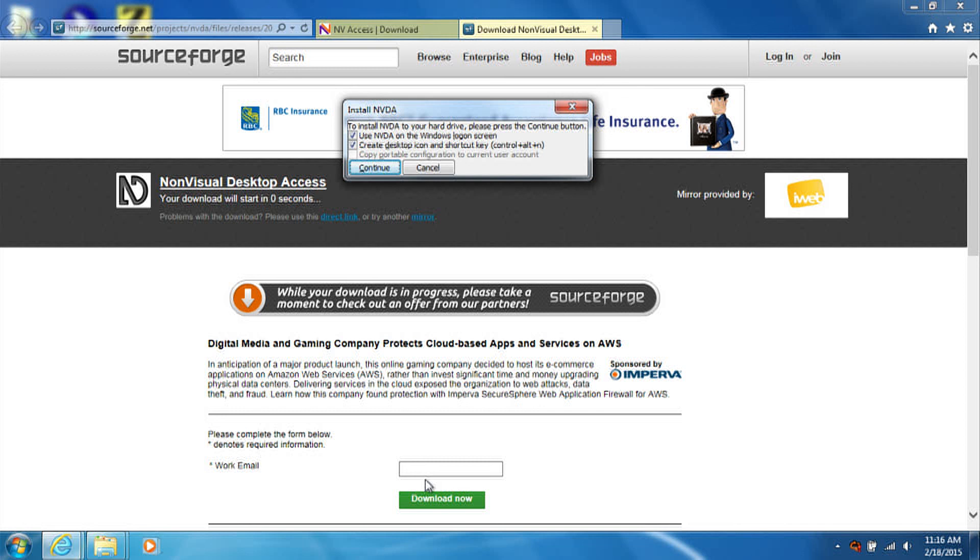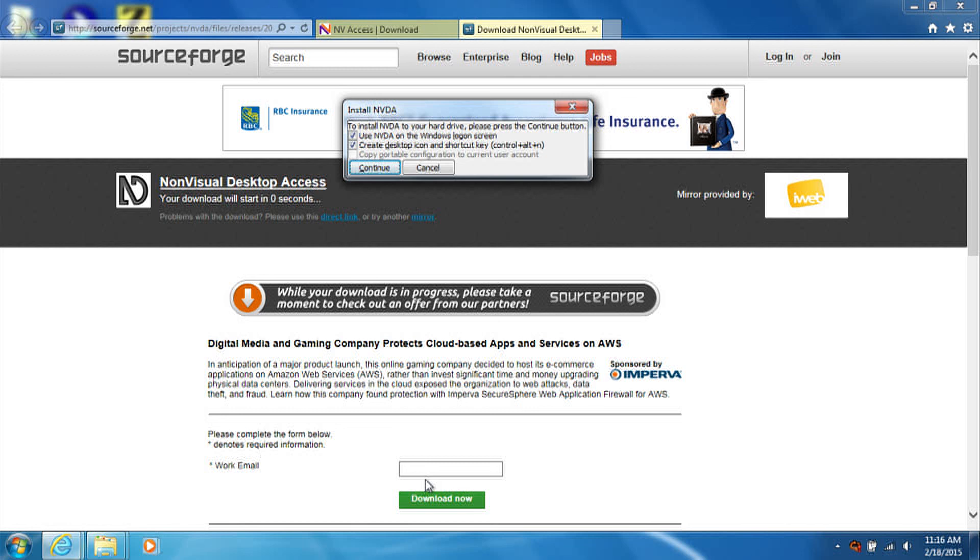On the next screen, there are a series of checkboxes. You can press tab to move through these controls, and press spacebar to check or uncheck them. The default settings should be sufficient. This will run NVDA when Windows starts, and set up a shortcut on your desktop to start NVDA easily.